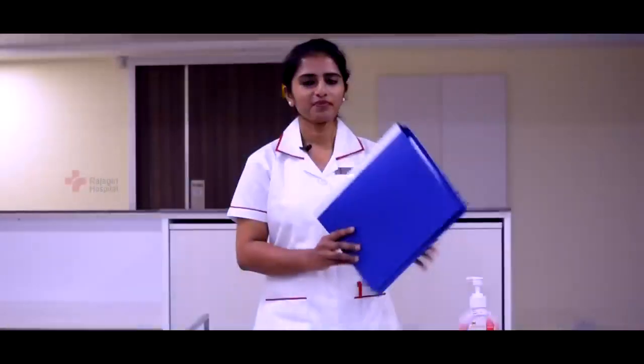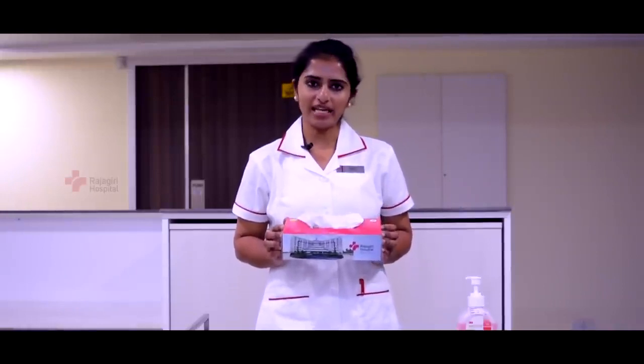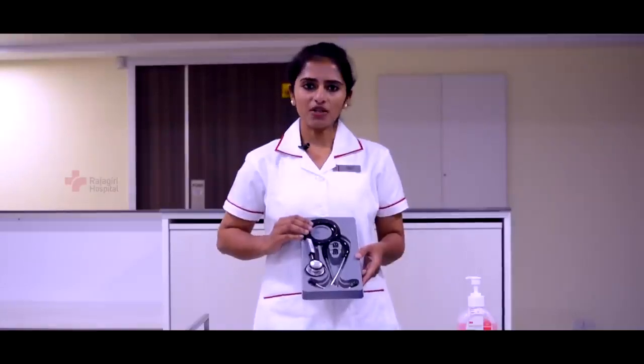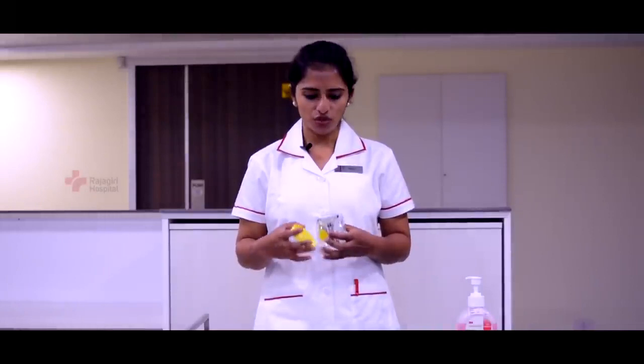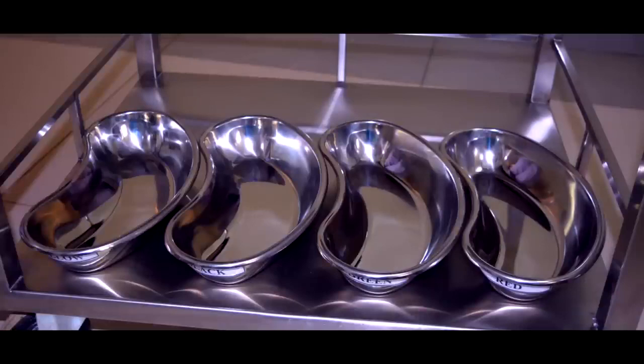The vital signs trolley contains the patient file for proper identification and documentation, hand rub to perform hand hygiene, towel or tissue paper to wipe the armpit of the client, digital thermometer to check temperature, wristwatch with a second hand to count pulse and respiratory rate, sphygmomanometer to check blood pressure, stethoscope to auscultate blood pressure, pulse oximeter to check oxygen saturation, alcohol swab to disinfect the thermometer and stethoscope, and kidney tray for waste segregation.